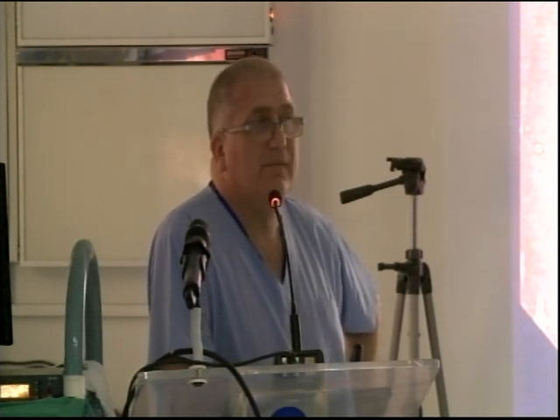Bet you never thought of this. Sorry? Tell me, what is the largest size polyp you can take off with a pair of standard forceps? En bloc. Right, so what I'm actually trying to get you to do is think about the head size of the forceps.